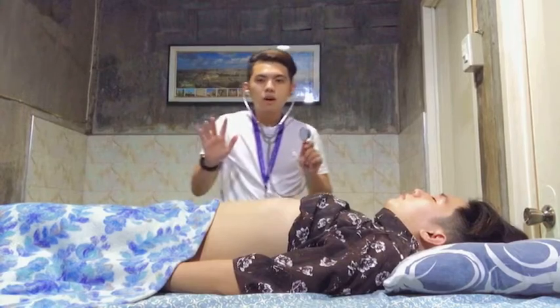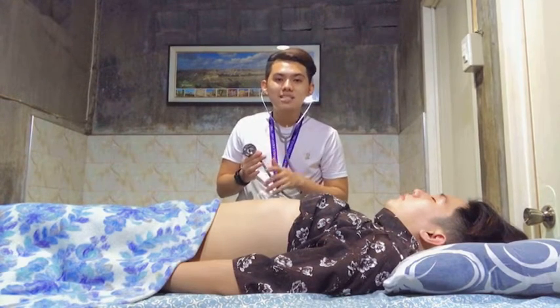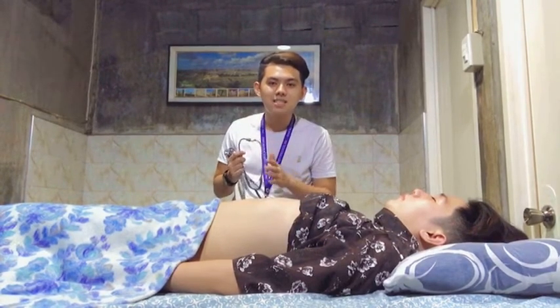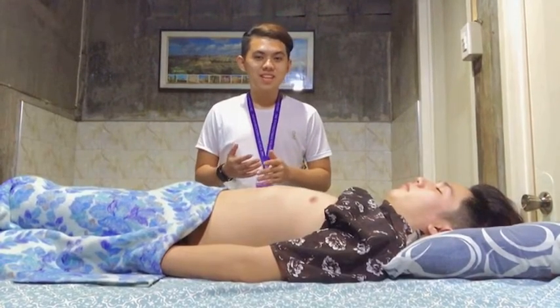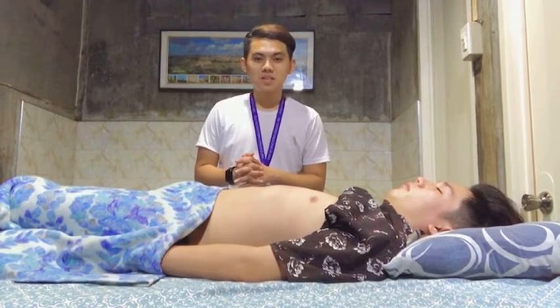Okay. So a friction rub over the liver is indicative of cancer in the liver with inflammatory changes or infection in or adjacent to the liver. It is also important to trace proximally the audibility of an arterial sound to determine the exact anatomic site of the flow disturbance. So after the auscultation, let's proceed to the percussion part. So with the percussion hand technique, lightly and systematically percuss all quadrants.